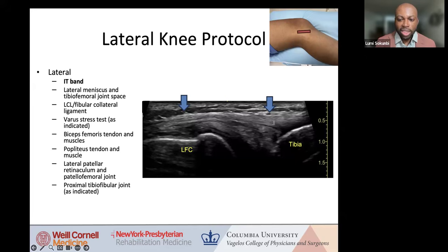It's hard to assess the two anatomic layers with ultrasound, but as you see in this picture, it does fan out as it inserts onto the tibia. So it's important not to confuse this with a sign of focal tendinopathy. It's really just how the fibers are attaching and inserting in that area. In cases where there's doubt, you can always use some local compression of the probe and see if it reproduces pain in patients with potential tendonitis or this IT band type syndrome.